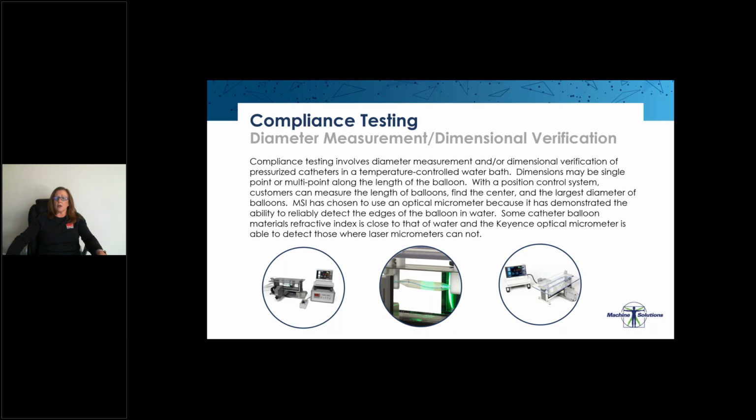MSI has chosen to use an optical micrometer because it has demonstrated the ability to detect the edges of the balloon in water. Some catheter balloon materials' refractive index is close to that of water, and the Keyence optical micrometer is able to detect those where we have found the laser micrometers cannot.